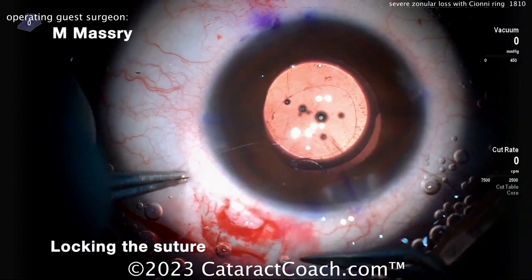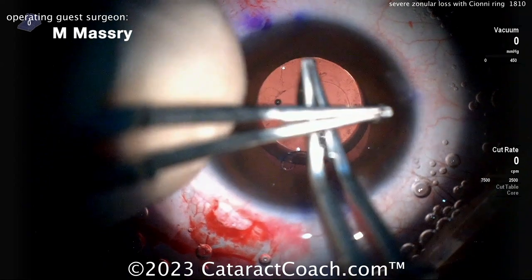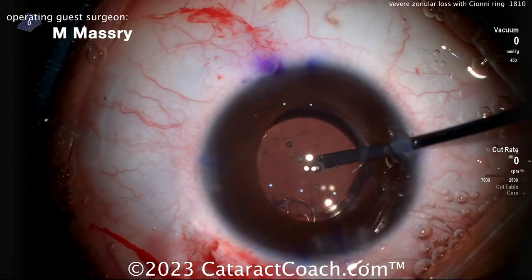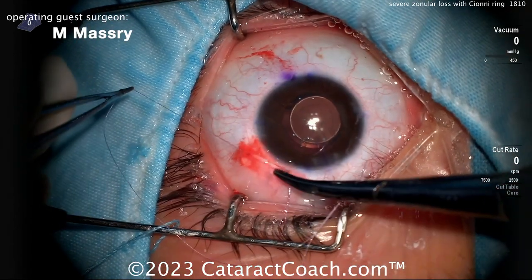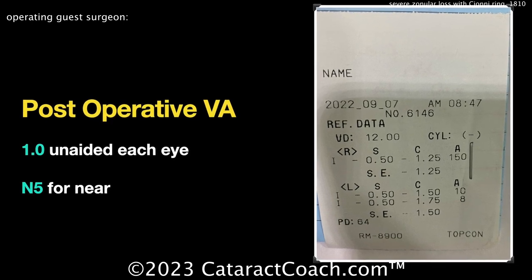Now locking the suture — remember you kept that needle on for a reason. You've got to tie that suture down and get it locked in. When it's done, the case looks fantastic — beautifully centered lens. The post-op result was also fantastic for this patient. Great post-op result, beautiful case — thanks for sharing.